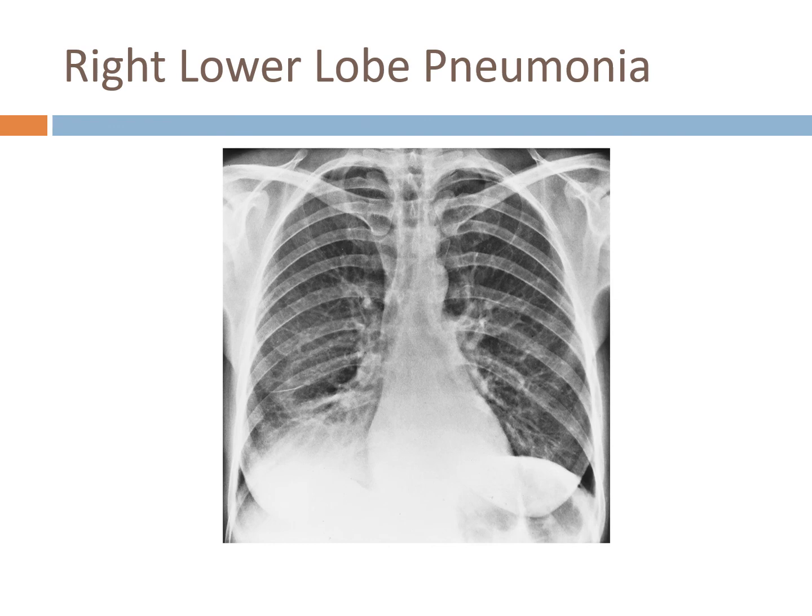To diagnose a pneumonia, in this case here we have a right lower lobe pneumonia. You can see your costophrenic angles here on the right side of the patient, the left side of the picture, are obscured, and you can't really make out the definition of the lung itself and the diaphragm.